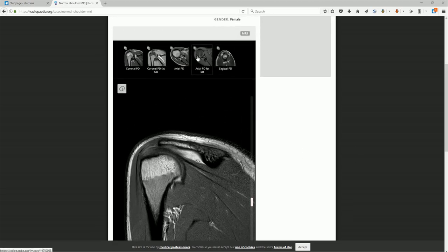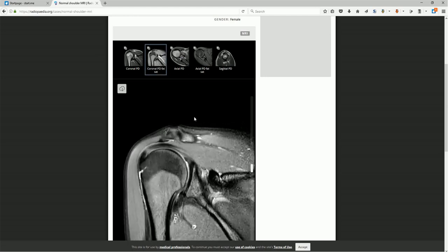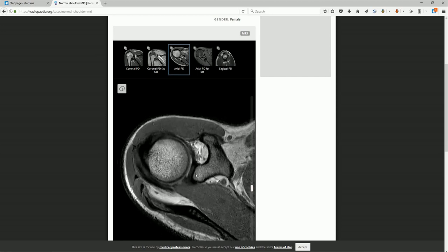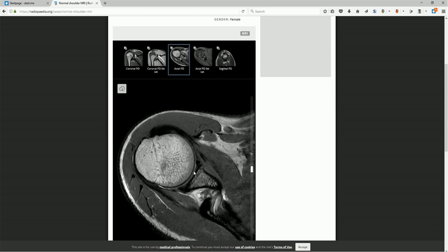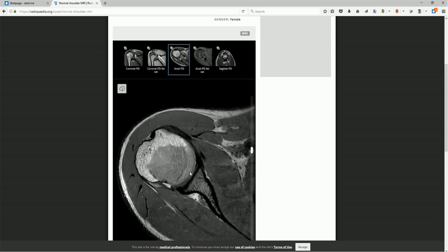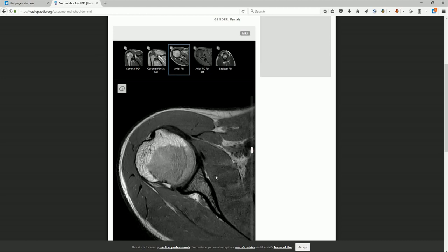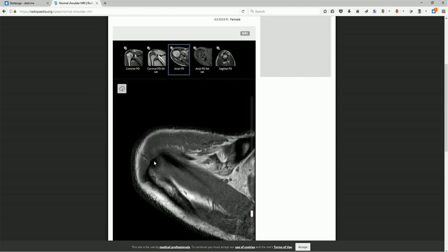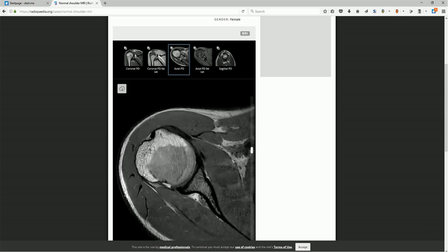Here's an axial view with a slightly different weighting density. As we move up and down, the coracoid process is there, the glenoid fossa articulating with the head of the humerus. We can see more of the humeral head, the deltoid muscle, infraspinatus, subscapularis. Moving back up, there's our supraspinatus as we move superiorly, coming across to attach into the supraglenoid tubercle out here. Then we can see the infraspinatus also coming into that spot. Moving to a sagittal view — that should be our coracoid process moving into the glenoid fossa and then the head of the humerus. That would be your acromioclavicular joint where the acromion meets the clavicle — supraspinatus muscle once again, infraspinatus on the posterior side, subscapularis muscle over here.